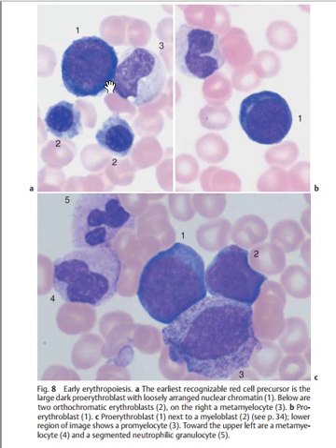And then on this side here, we have the metamyelocytes, and the metamyelocytes are involved in white blood cell hematopoiesis, not in red blood cell hematopoiesis. You see, this metamyelocyte has a small U shape. We are not going to speak about that in red blood cell hematopoiesis. In red blood cell hematopoiesis, you start with the pro-erythroblast, then we have the orthochromatic erythroblast. When I say orthochromatic, it means that it only has one color.